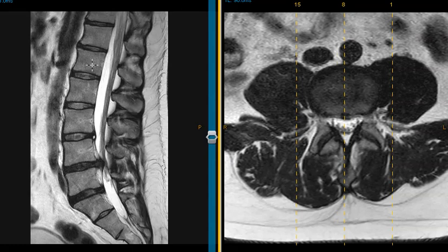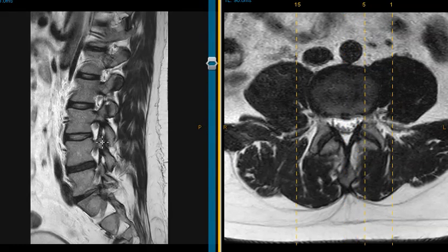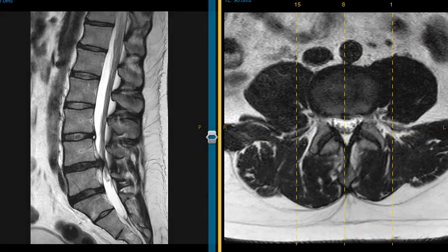So we should see the bony column here. Behind it we see fluid in the spinal canal and also some nerves. And then back here we see these spinous processes. These are bones in back. So bone in front, bone in back, and the fluid-filled spinal canal and the nerves. Now we're going to find that disc herniation. So this looks great. Nice disc.